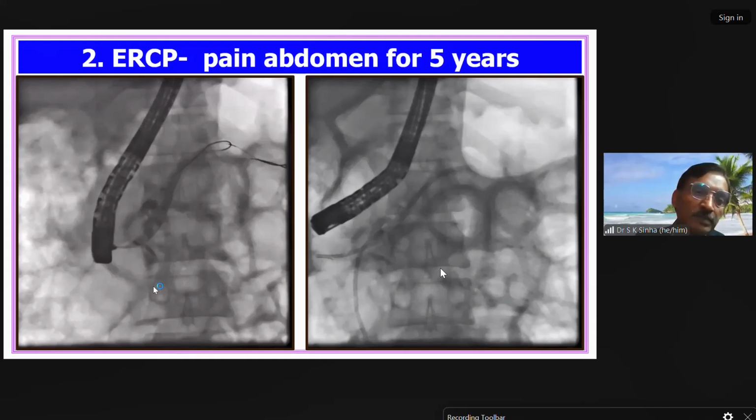Here you see the shaft of the wire has very poor radio-opacity, but the tip, 5 centimeter, as we discussed in the Jagwire and also in the VisiGlide, is very briskly radio-opaque. This is because the companies provide extra material there, either platinum or tungsten, and in Jagwire we had discussed that it is tungsten loaded.